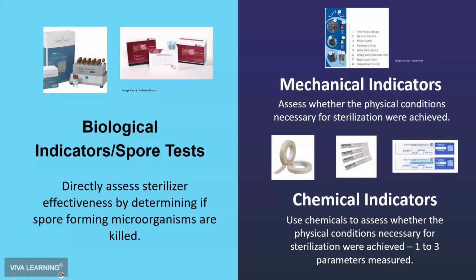In other words, if I use an indicator in every sterilizer load, that means that my sterilizer is killing all the microbes. And it probably is if that particular integrator or integrating indicator passes, but it is not the absolute validation of a spore test that we know we've killed all the microbes. So that's a given, must be done.